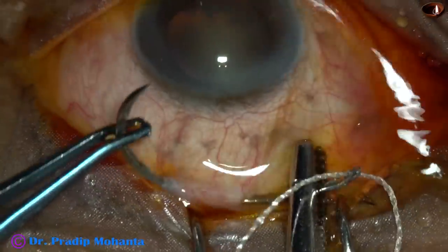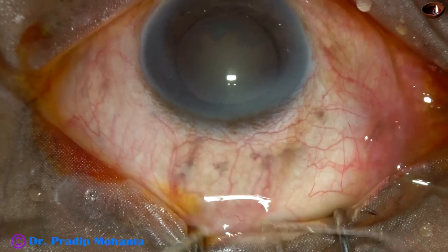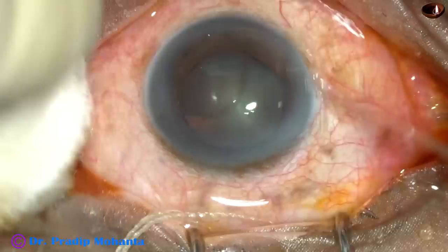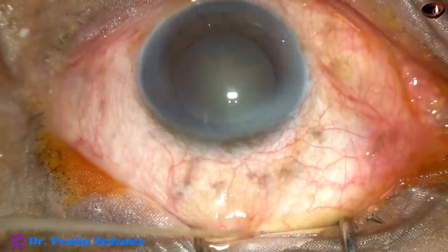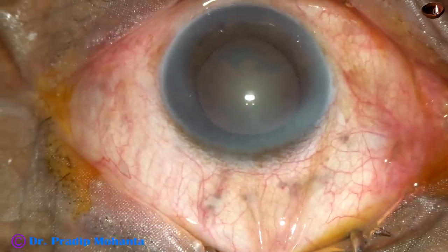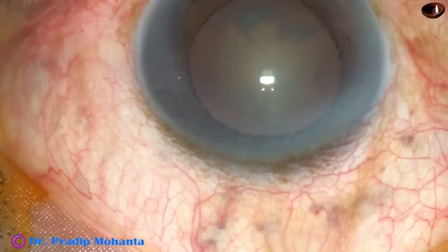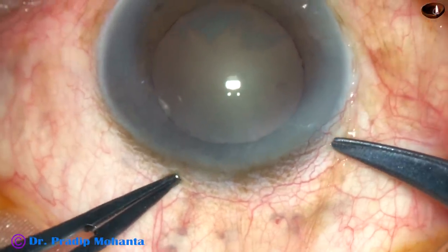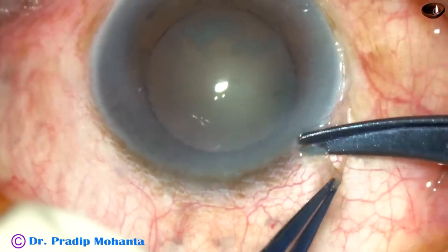This step is very important for a first-year ophthalmology resident who is going to start SICS. The ocular surface is thoroughly irrigated, applying povidone iodine. If you pull the superior rectus bridal suture, the eyeball turns a little down and becomes stable — it acts like a third hand, making the eyeball stable and turning it a little down.